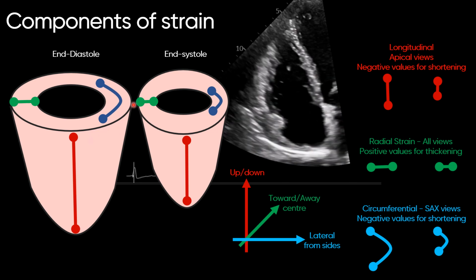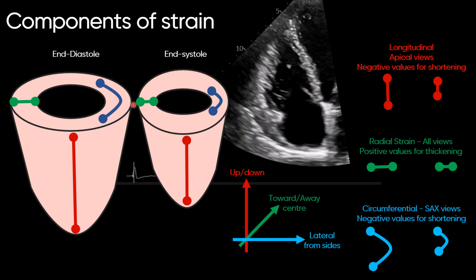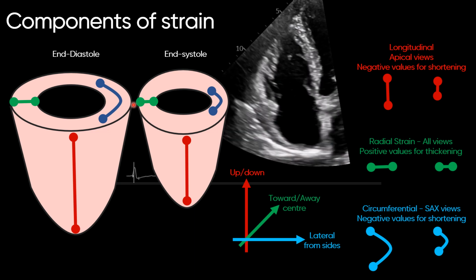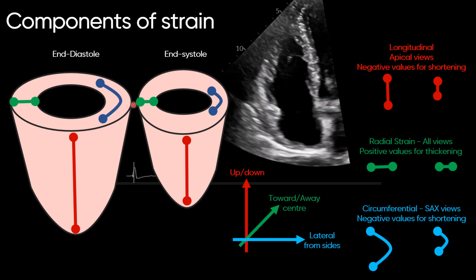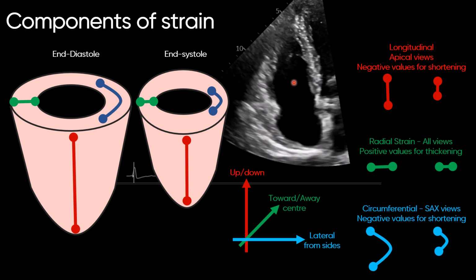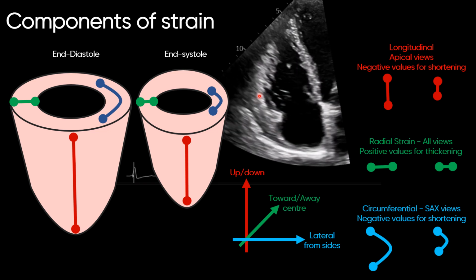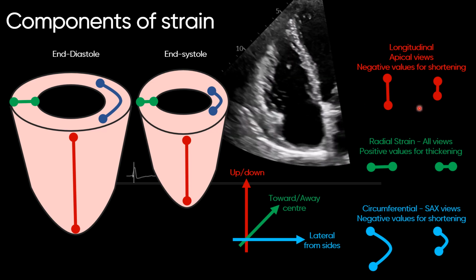However, the current focus is mainly on the longitudinal strain, and more light is being shed on the other components in current literature, as well as how robust it can be in 3D echocardiography, which will come later, as one cine loop can represent all the required sections to analyze the components in different directions, while two-dimensional echocardiography and the strain analysis there requires multiple views to represent different sections and depict the change in the form, which is the strain analysis.